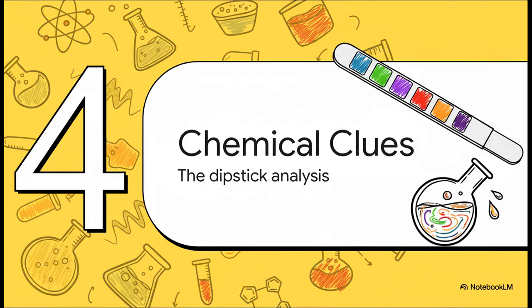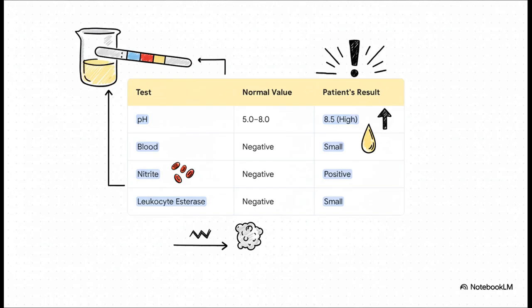It's like a mini laboratory on a tiny plastic strip. Each of these colored pads is loaded with chemicals that will change color if they detect certain substances, giving us a ton of diagnostic clues really fast. Now let's focus on the most important results for this case.